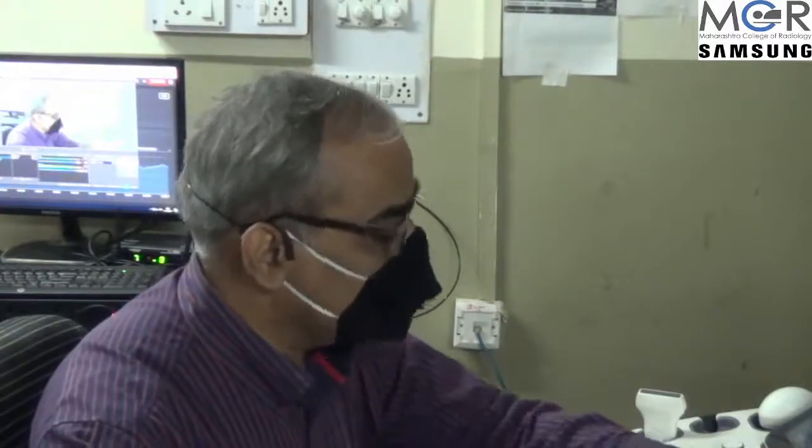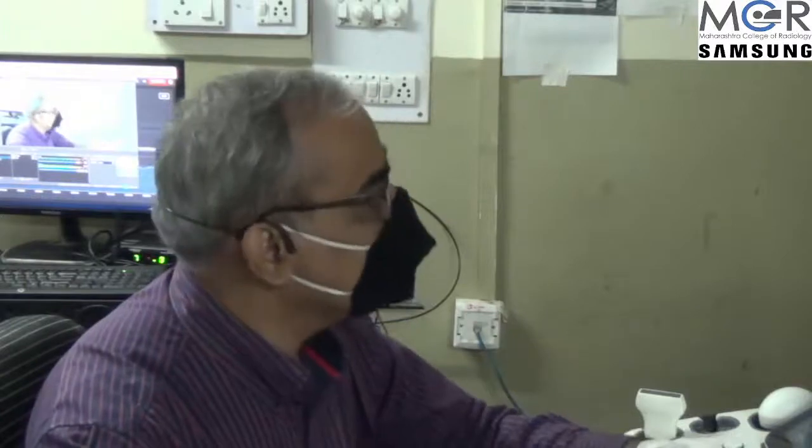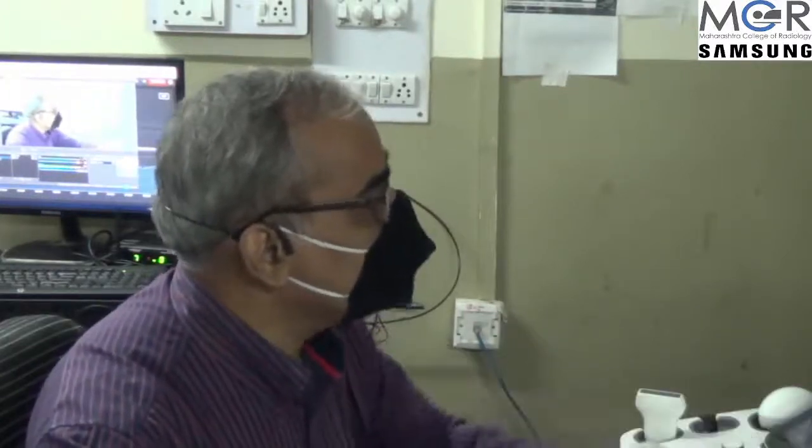You can see the anterior chamber, the cornea is normal. You can magnify the image to see it nicely. This reverberation you are seeing is due to the IOL. Patient is operated on this side, and IOL gives us reverberation. You can see the sides. Try to see the iris and ciliary body, because we are interested in the anterior chamber, or anterior segment, on the other side. Now I go to the left side.